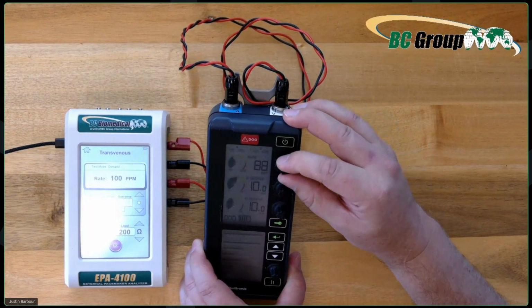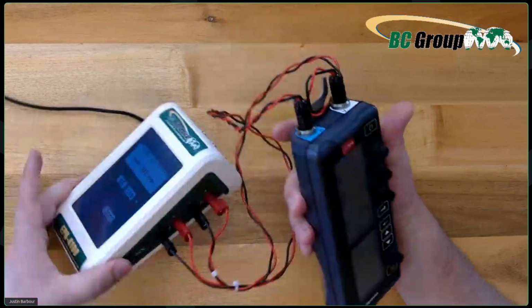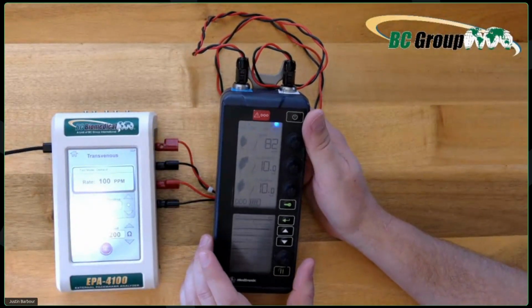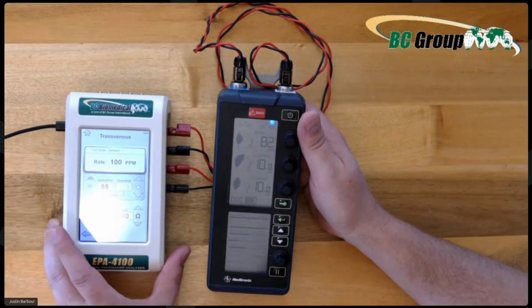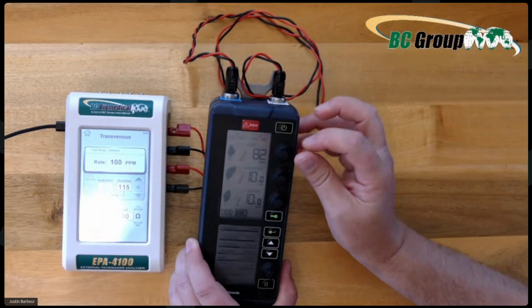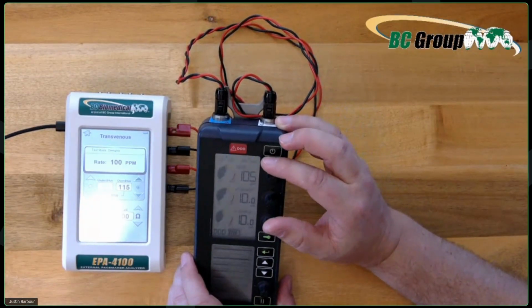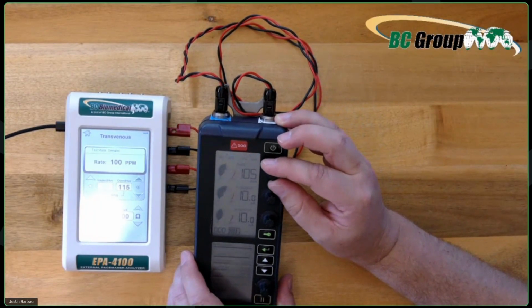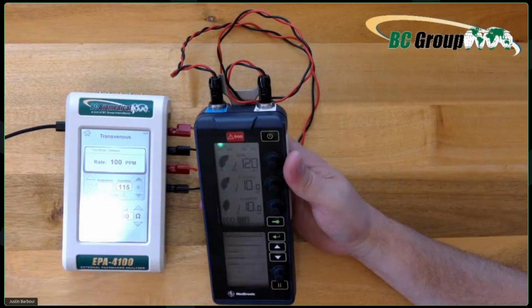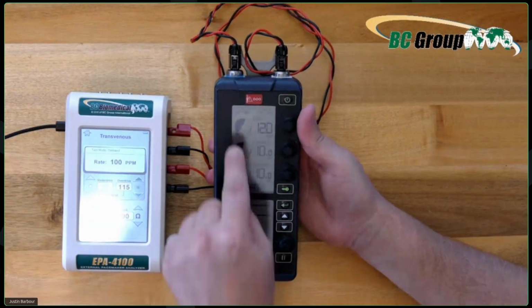So when we turn it down below, the underdrive, you'll see that some of the pacing lights will stop. And that is because you're testing out whether or not the heart needs to be paced. So we can go to overdrive, and this way here, we're sensing the maximum. You can turn this guy up. You can see the status lights up here showing blue. That means it's sensing that there is a heart rate. And if we go over 115, notice how all of a sudden I start pacing, probably to slow that heart down. So always pay attention to your indicators.